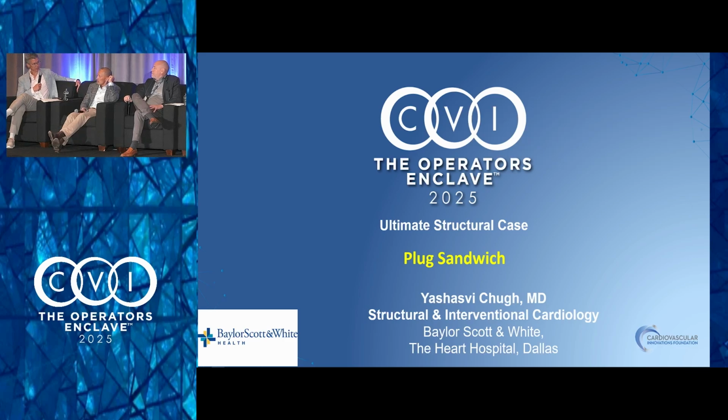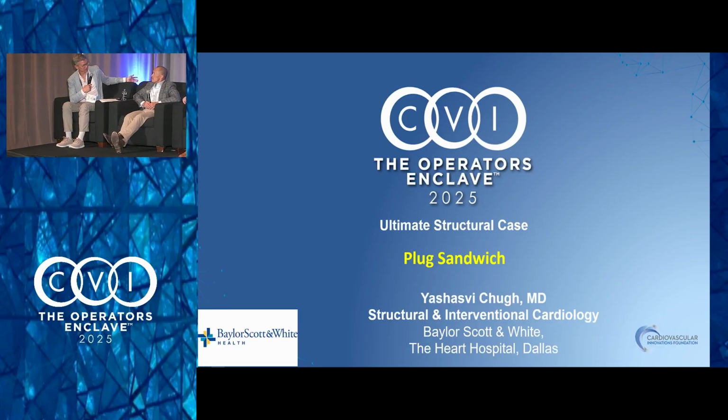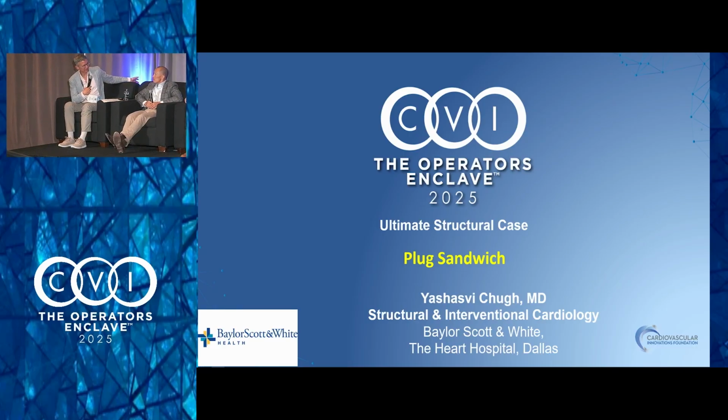Yeah, I mean, the real challenge was just wiring it. Everything's moving in a different direction. Your apical sheath is moving with the LV, then the LV is pumping around, and then the valve itself is moving independently. So how you navigate all that, it's very difficult, right? Sometimes a curve on the wire works against you, like the pre-shaped wire. It's better to go just with the straight wire.